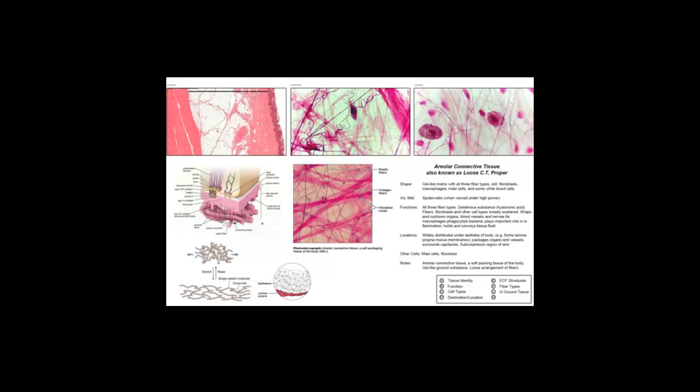Now, what we focused on in this slide is the areolar connective tissue, or the two-sided tape that's forming the binding and support of adjacent tissues that are unlike one another. So underneath the epithelial tissue here, we would find this tissue, areolar, in between any structure that's different from the denser regular of this layer, like these two blood vessels, the artery here and the vein, and if that has around it a different kind of tissue, which it would, this artery would be surrounded by a smooth muscle wall, as would this large vein, but it wouldn't always have muscle if it's a vein.